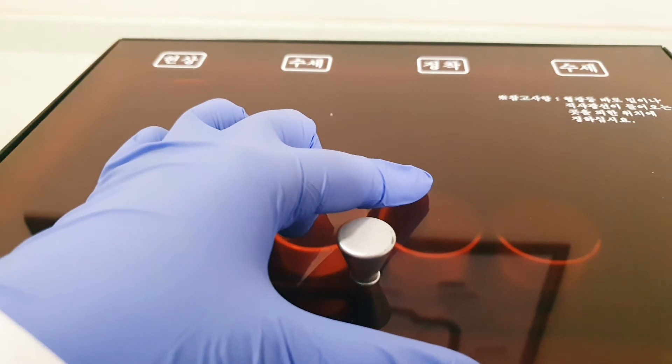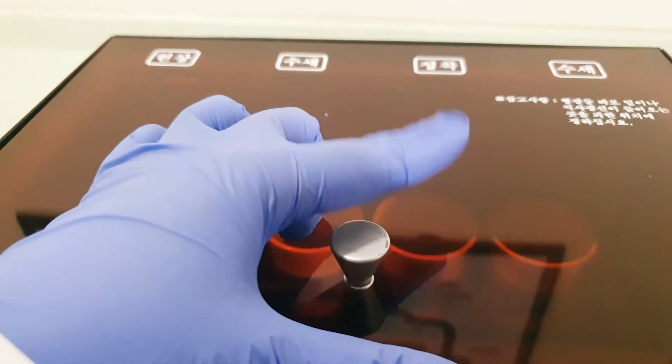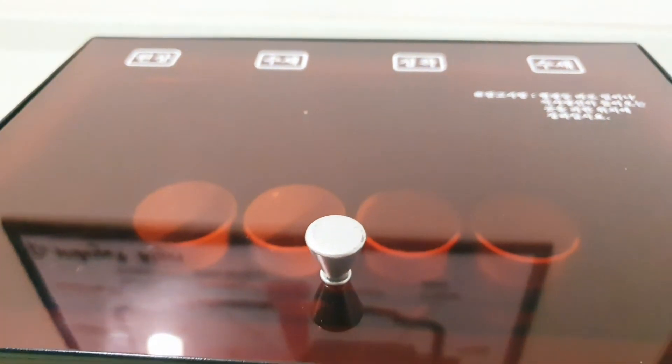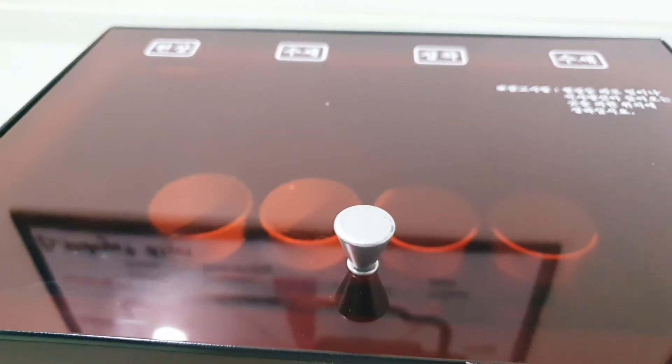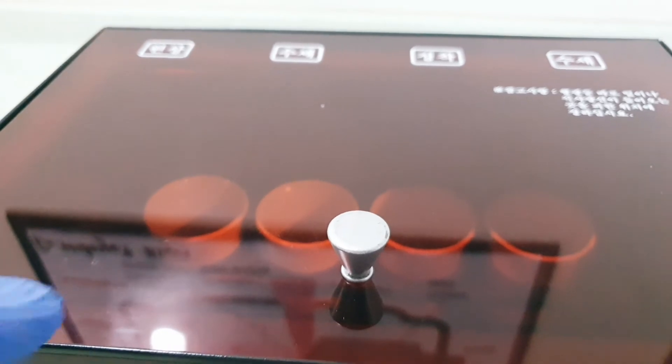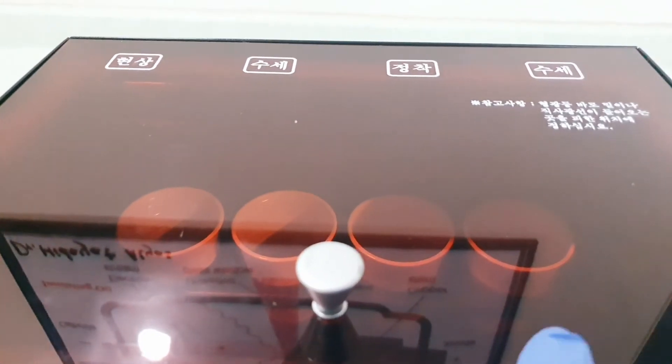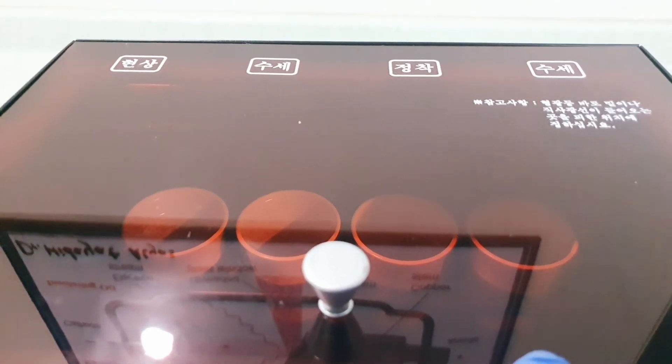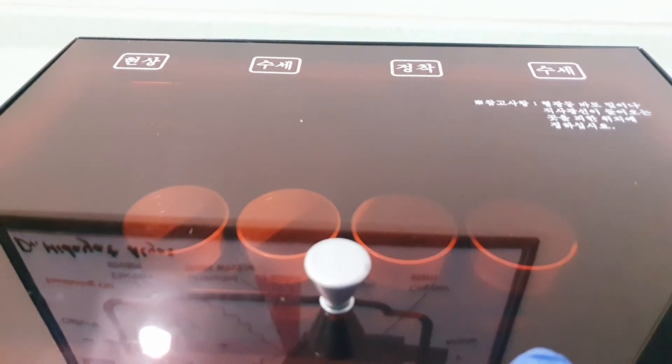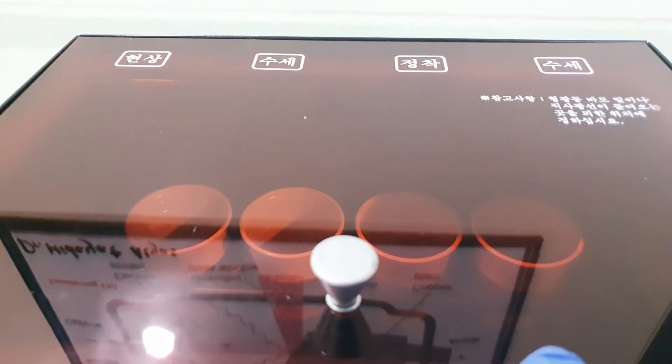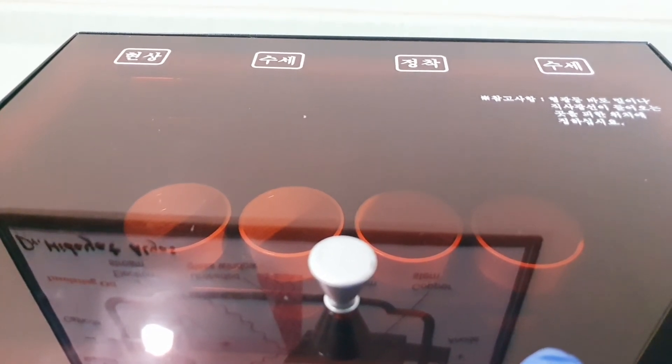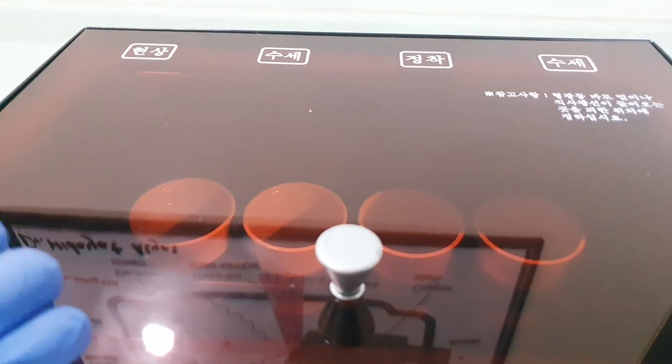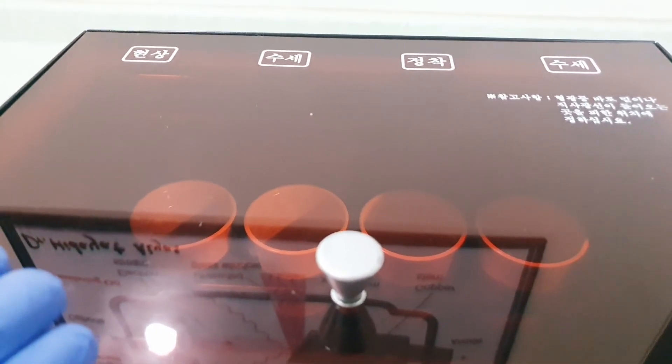After fixing, there should be no white areas visible when viewed under the red-tinged glass. If white areas are still visible, keep it in the fixer longer. When you see only black and bluish translucent areas under the red-tinged glass, fixing is complete.